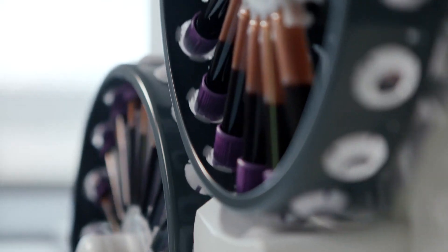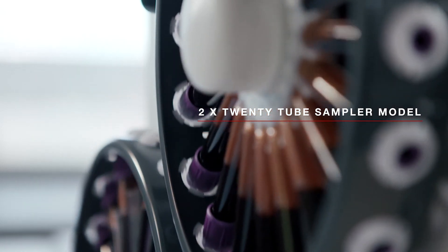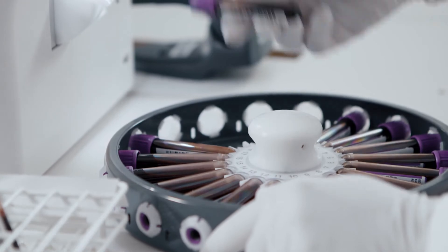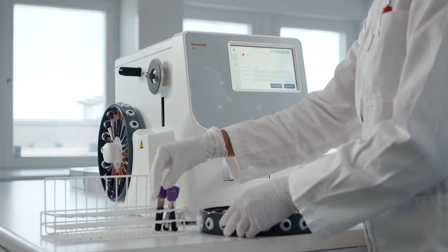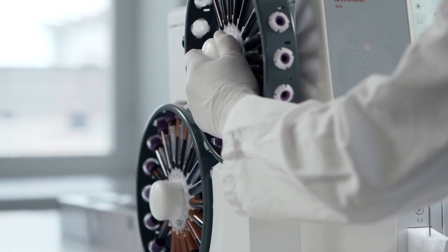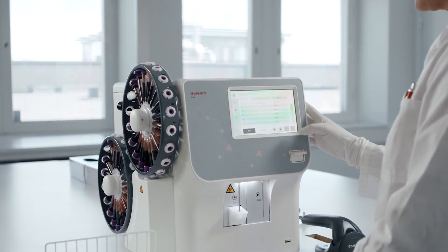For labs with higher than average test volumes, Swelab Alfa Plus is also available as a 20-tube sampler model, giving true walk-away capability. Other suppliers may offer a similar sampler, but it often means buying larger, more expensive equipment that also costs more to run. Whatever the sampling method, you'll see the results on a full color touchscreen in just about one minute.